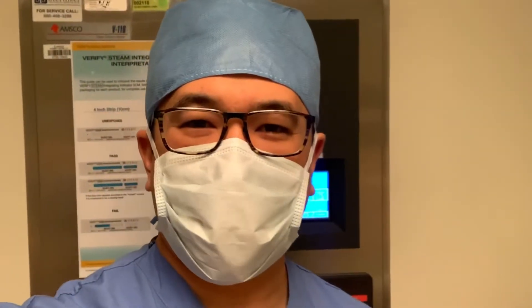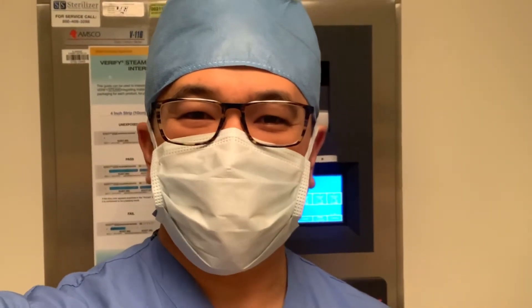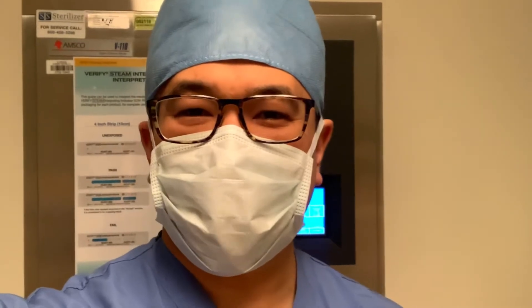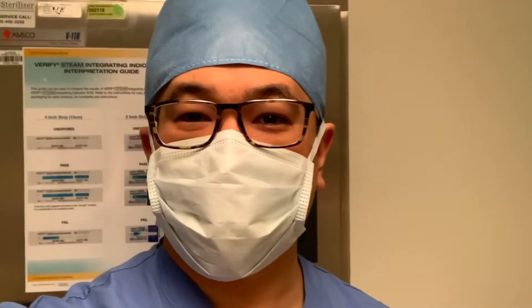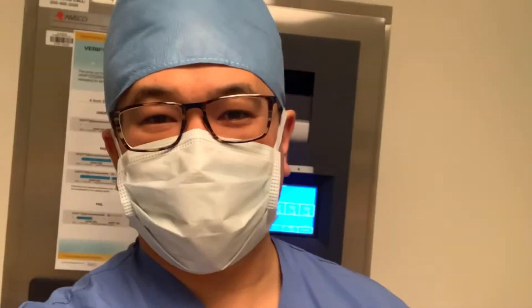The new Clarion lens for cataract surgery. What is it? What is it like to use? Today, I'm going to take you into the operating room with me to look at this new lens. If you're interested in cataract surgery or want to see this new Clarion lens being implanted, then come along.